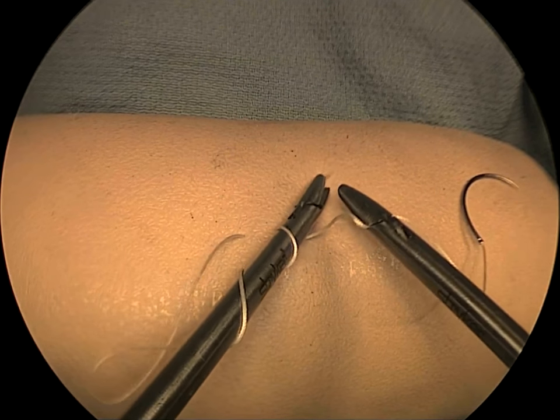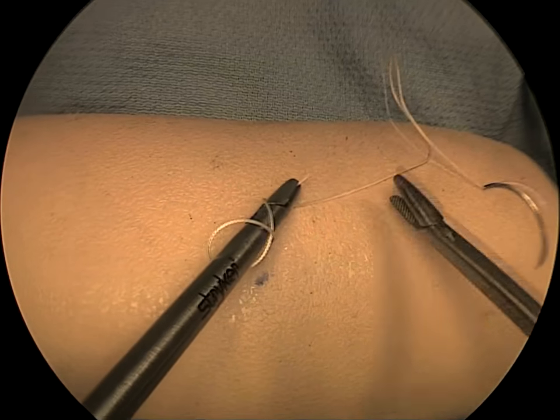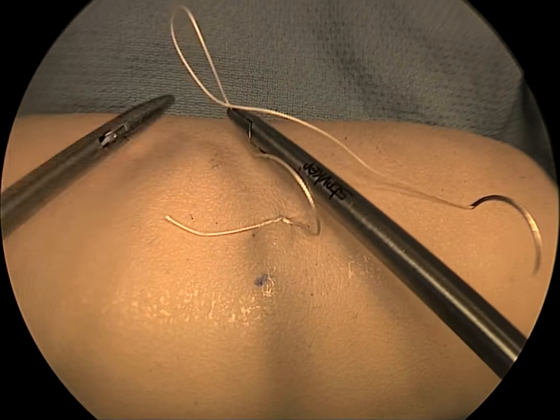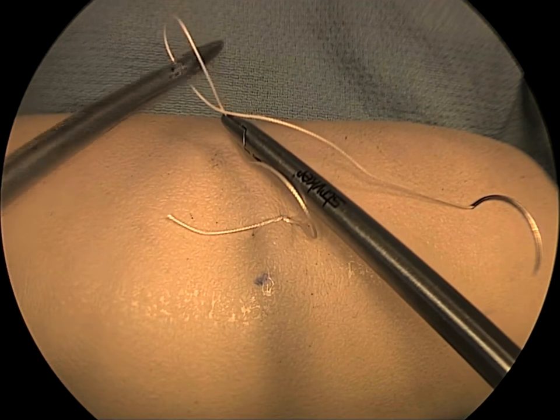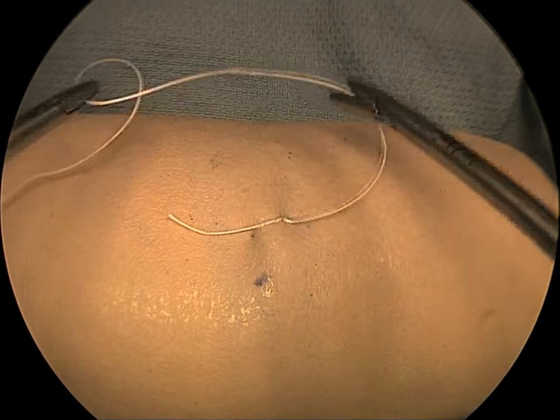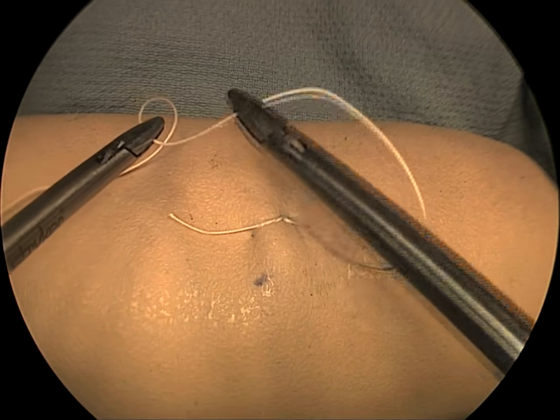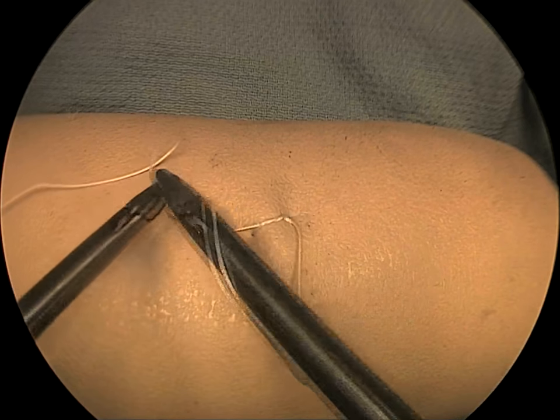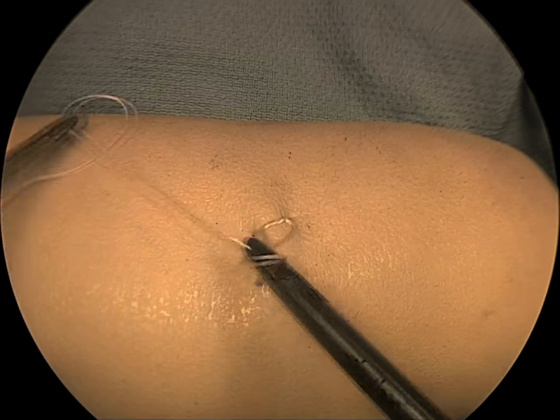The two winds are unloaded onto the tag without pulling or lengthening the tag end. The pronation of the suture length back towards the tag is again accomplished, and the suture re-grasped now in the left instrument. A second forward wind is demonstrated and tightened.